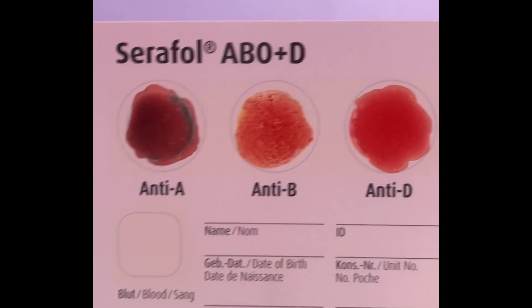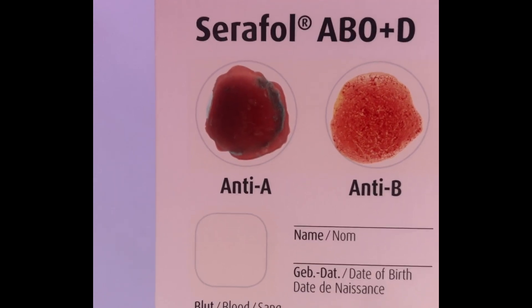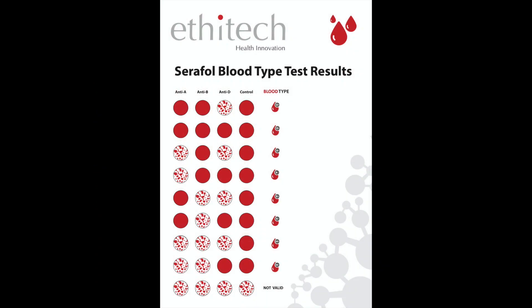Keep turning the card in a circular motion for approximately 30 seconds so that the drops circle in the reaction field. Then observe for agglutination. If agglutination is visible in the reaction field, it is equal to a positive reaction. If it is not visible, it is equal to a negative reaction.